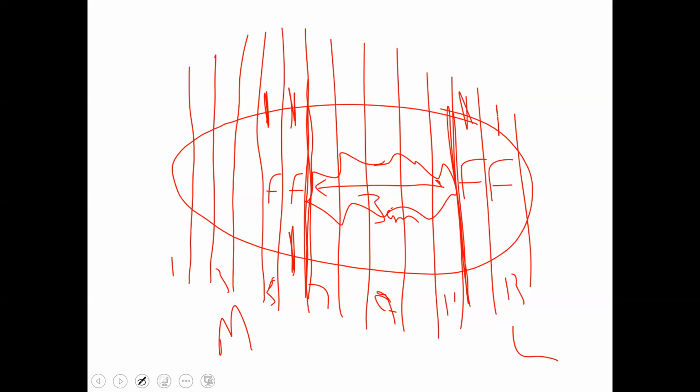For example, if we're looking at this case together, and you tell me that I grossed it and thought there was tumor in slices 7 to 11. However, we look at the slides together, and slice 5 also has tumor, and slice 6 also has tumor, and slice 12 also has tumor. I'm going to come back to you and say, okay, it looks like the tumor was not as apparent as you thought.